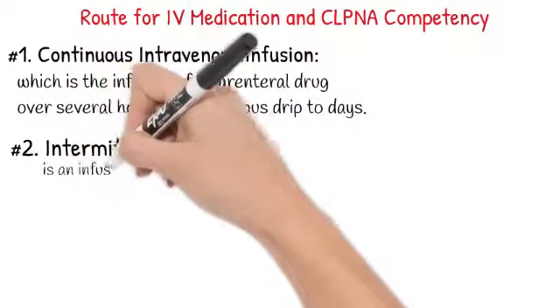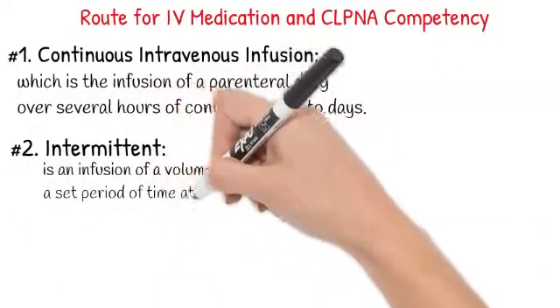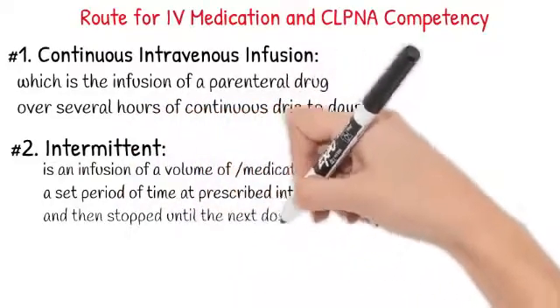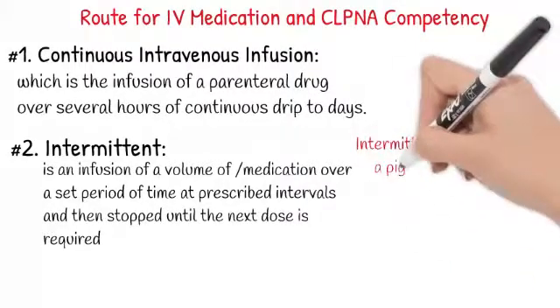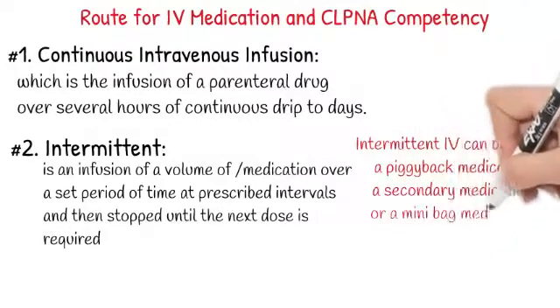Intermittent, which is an infusion of a volume of medication over a set period of time at prescribed intervals and then stopped until the next dose is required. Intermittent IV can be called a piggyback medication, a secondary medication, or a mini bag medication.